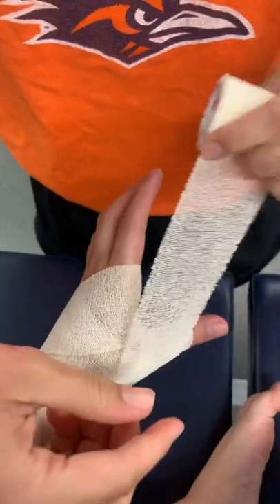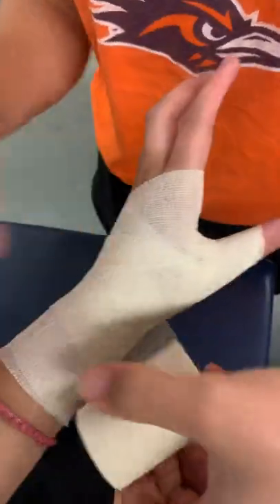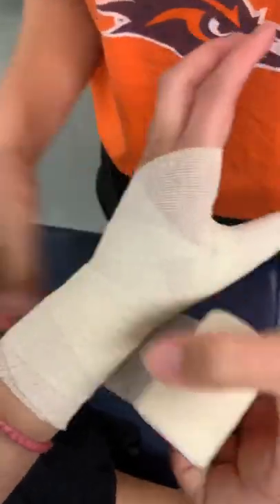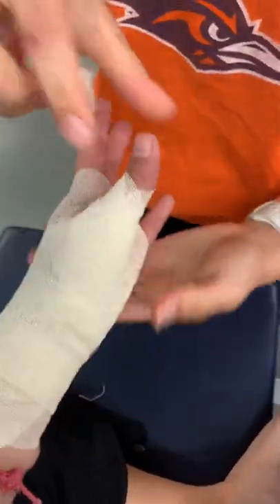Go over that joint line again. Then to their preference — they will tell you — you finish it off at the wrist. And that is the thumb spike up.